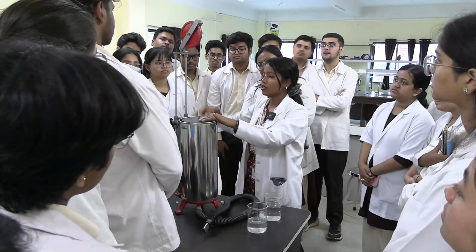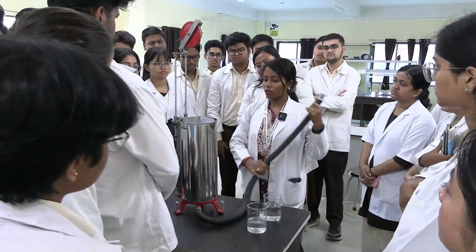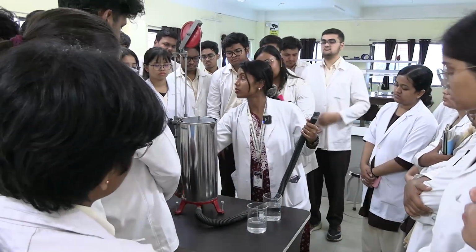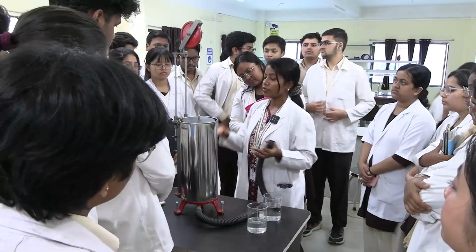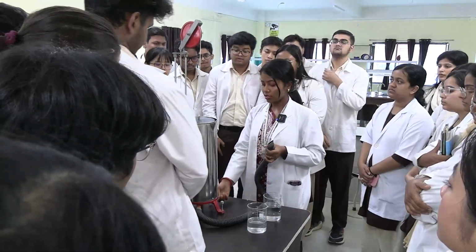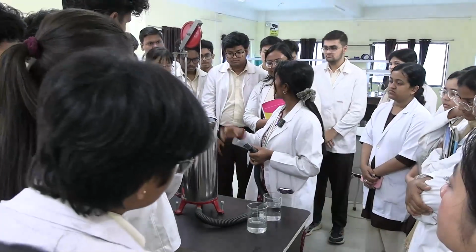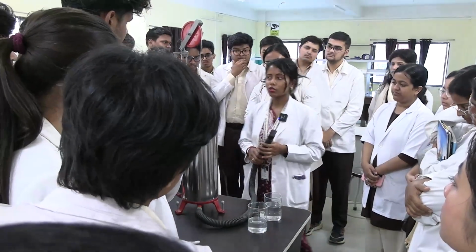So vital capacity, how are we going to perform it? And this is the mouthpiece. This is the corrugated rubber tubing. These are the leveling screws, which are to balance the water. If it is tilted to one side, while you are performing, there will be some kind of friction. And this is the water outlet, so you can drain the water, then you can fill it. This is the mouthpiece.